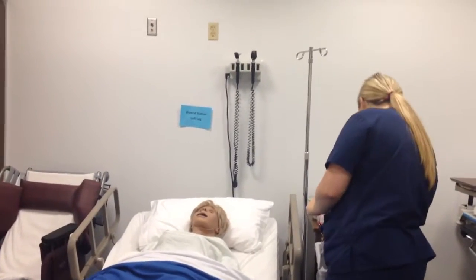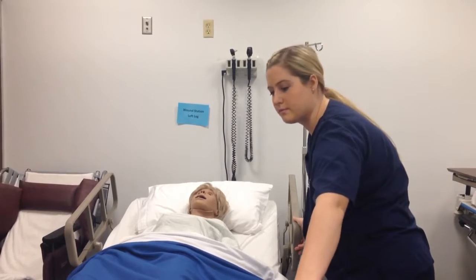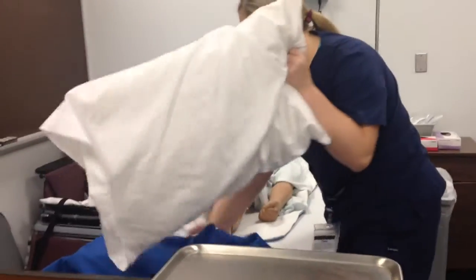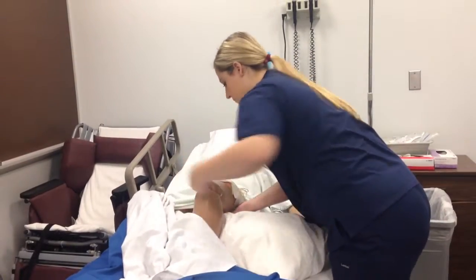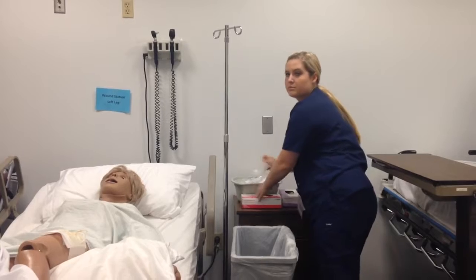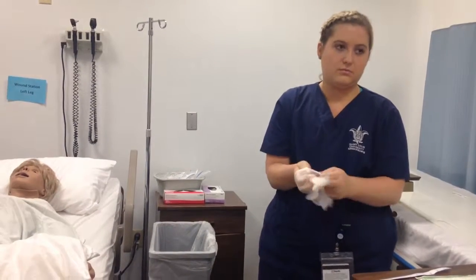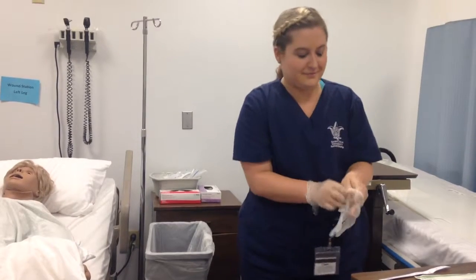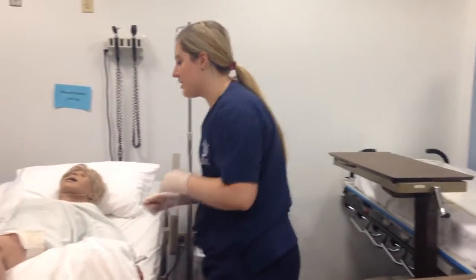I'm going to take your dressing off and then give you a new one. So first I'm going to raise you up to my height for a comfortable position. Okay, and then I'm going to place a pillow underneath your leg so I can have better access to your wound. Okay, and now I'm going to put my gloves on. Okay, so we're going to take your dressing off.